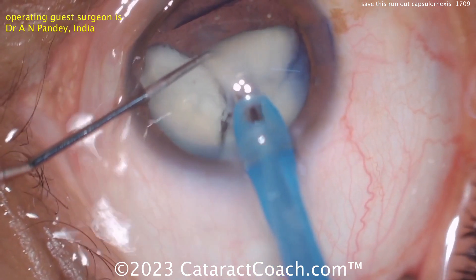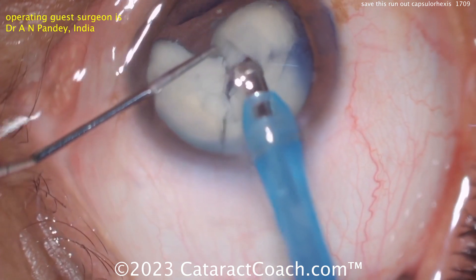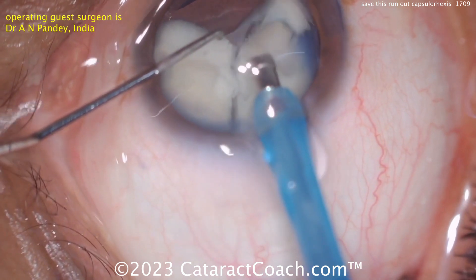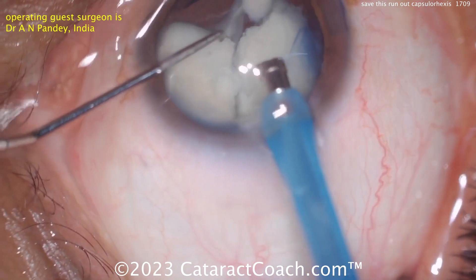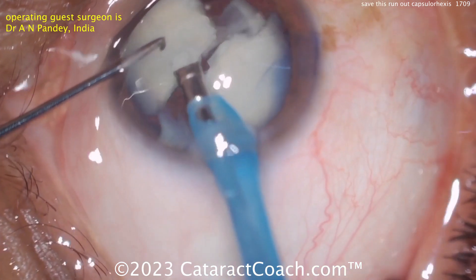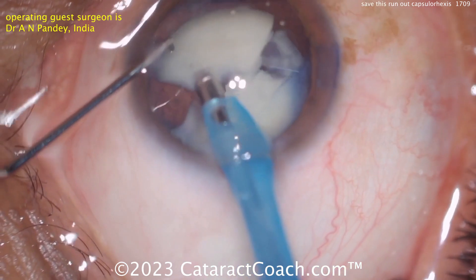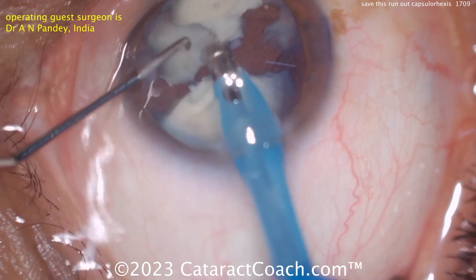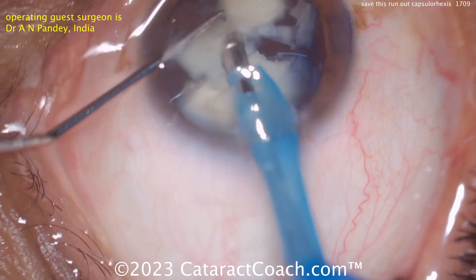Taking down that nucleus again. As you do this, keep an eye out in that one quadrant at the top of your screen — just out of our view — you want to make sure that's not going to rip around to the posterior, because if it extends you could drop nuclear pieces into the vitreous cavity.